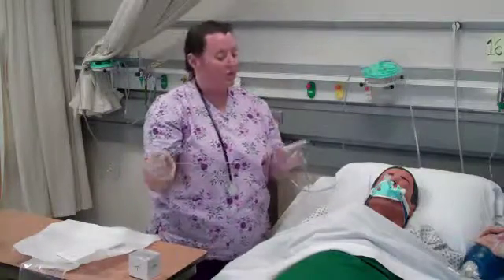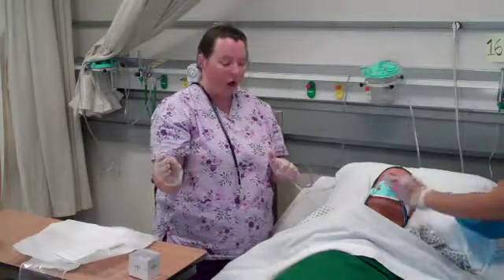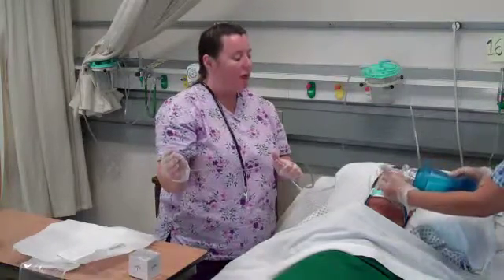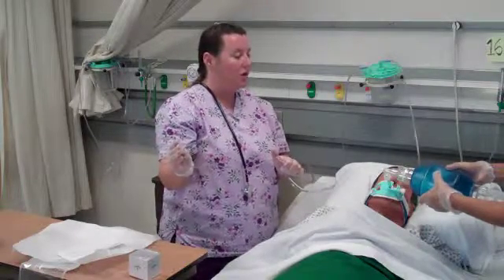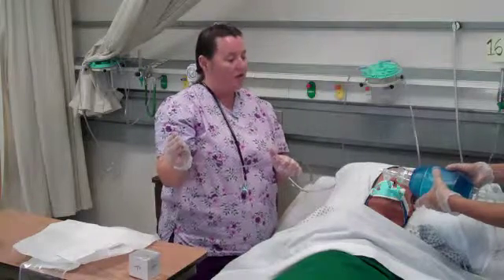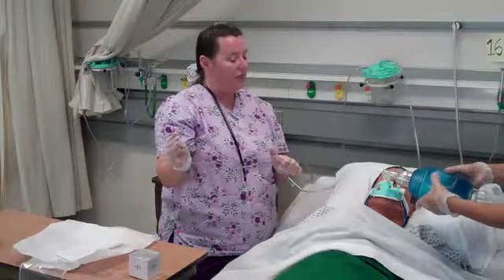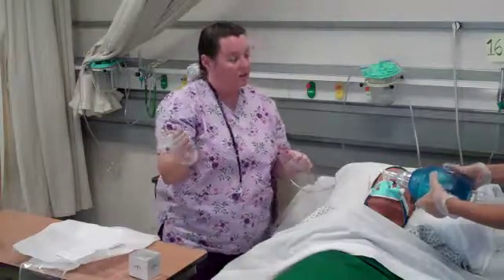I'm ready to suction a patient, but before I do so, my assistant's going to give my patient some supplemental oxygen. They're going to hyperoxygenate the patient, do not hyperventilate. She's going to give 100% O2. The oxygen source is on full flush. She's going to give the patient a couple of extra breaths. She's going to remove the patient from the source.